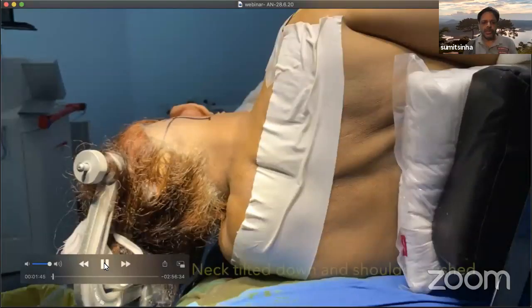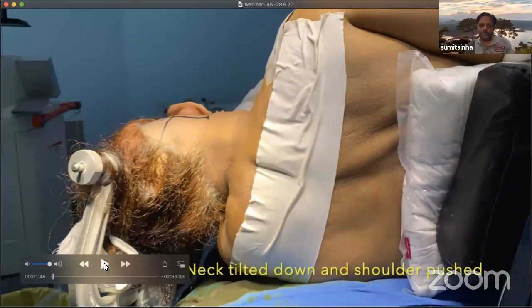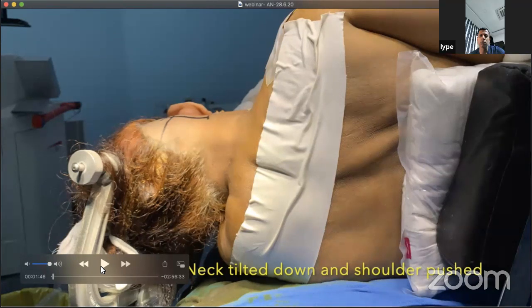The patient is of course in a lateral position and on a three pin. And this is what I was telling you. The shoulder is being pulled down. The neck is tilted, so that there is ample space. This is your operating room. This is your operating area. And you operate in a sitting position, of course. So when you tilt the neck down towards the floor, pull the shoulders and flex the neck, this area opens up so that you have ample space.